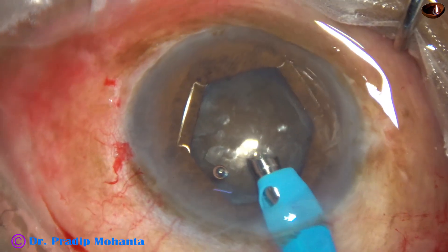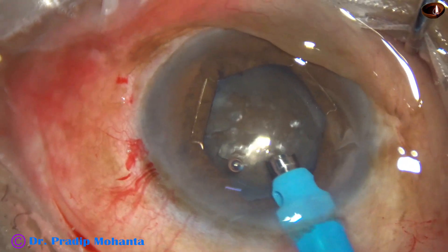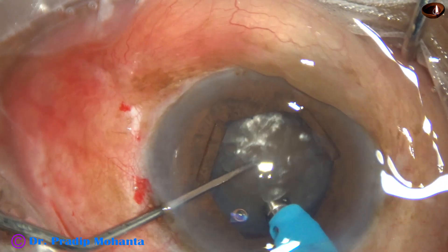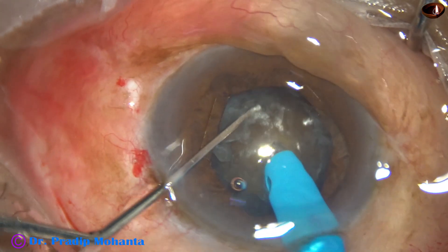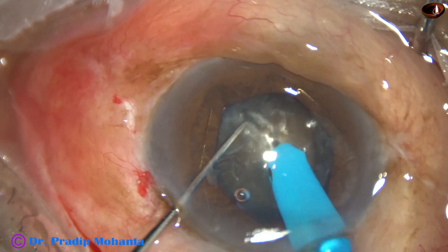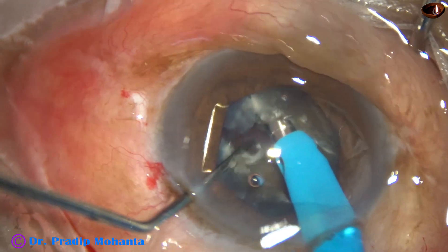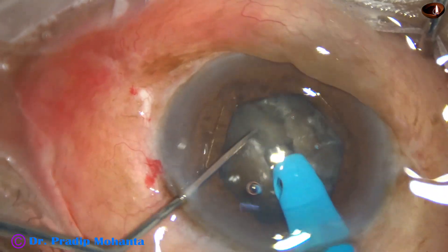My plan is to divide this nucleus using my technique called submarine chop. The tip is buried into the substance of the nucleus with full power — about 80% ultrasonic energy. The tip goes through the substance of the nucleus towards the opposite equator and reaches near the opposite equator. Then the chopper is used to get a nice crack. The chopper gradually goes down, so you can call it a sort of multi-level chopping.